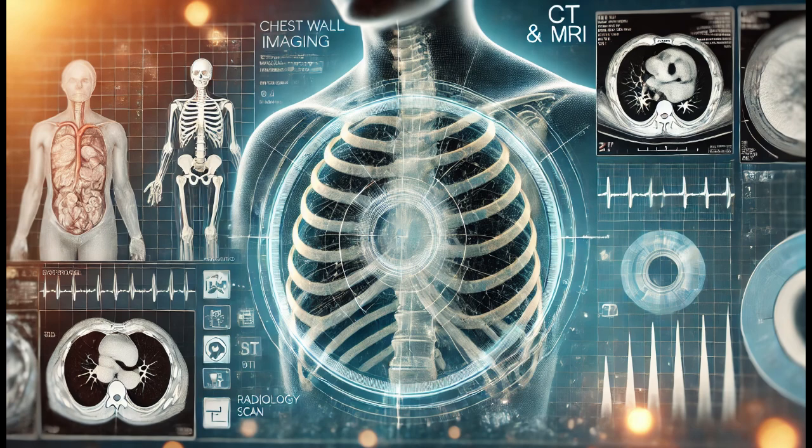So it's almost like a progress report, but for the inside of your body? Exactly. It's especially important after heart surgery because the breastbone is divided during those operations. Oh, right. And we want to make sure that it heals properly. Sometimes it can become infected or it might not heal as well as we'd like, and we can see that on a CT scan. We call that sternal dehiscence. Sternal dehiscence. Okay, got it. That sounds kind of scary.